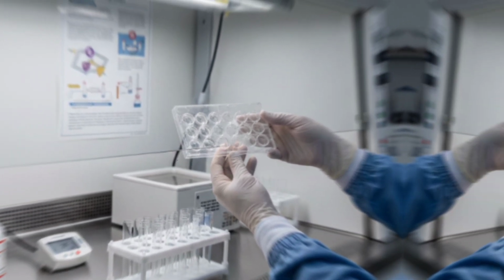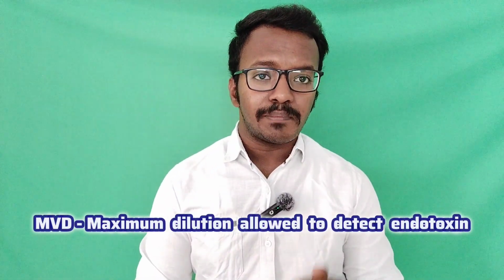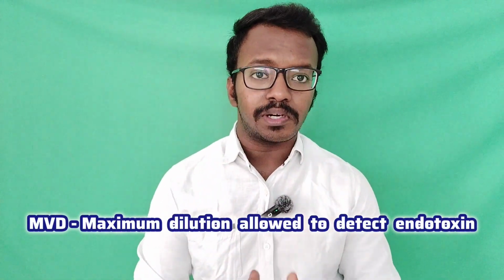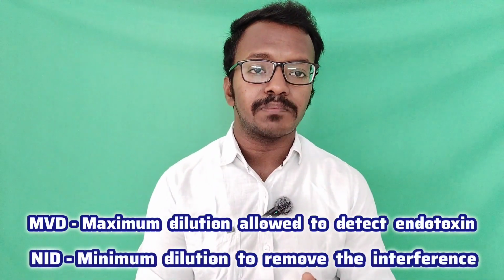We know that before performing the BET, the sample should be diluted based on the maximum valid dilution. The difference between MVD and NID is very small. MVD is the maximum dilution of the sample which is suitable for analysis. NID refers to identifying the lowest dilution within the MVD that reduces the interference and enables accurate testing of endotoxin from the sample. Simply, MVD is the maximum dilution allowed to detect the endotoxin, but NID is the minimum dilution to remove the interference from the sample.